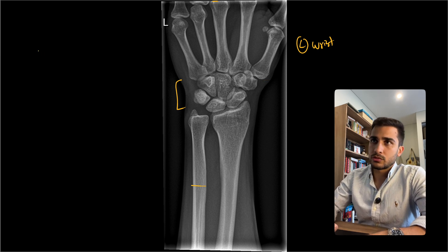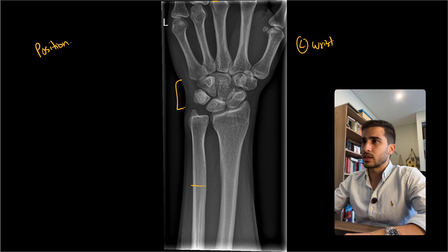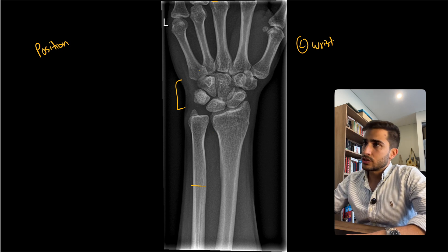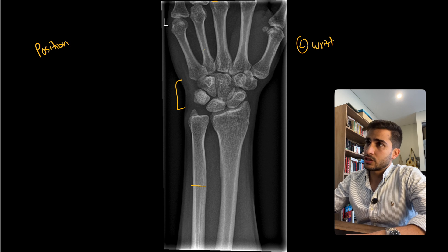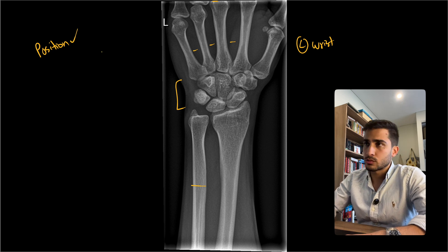Going through our PACEMAN critique, the first thing is position — is there any rotation, is there any tilt? Doesn't look like there's any tilt. Just squinting our eyes, it looks like it's within the vertical aspect of the image. There's no rotation either. The radius and ulna look like they're in their PA profile, and you can see through the joint spaces quite nicely as you would in a PA wrist x-ray. So positioning looks quite good.